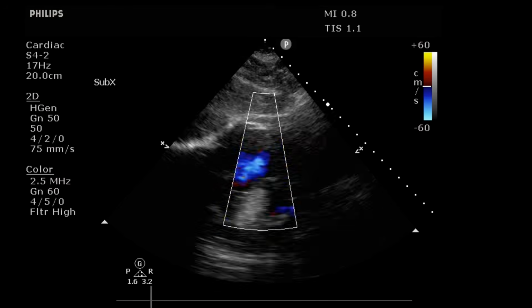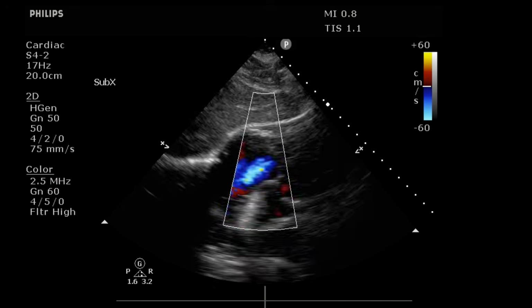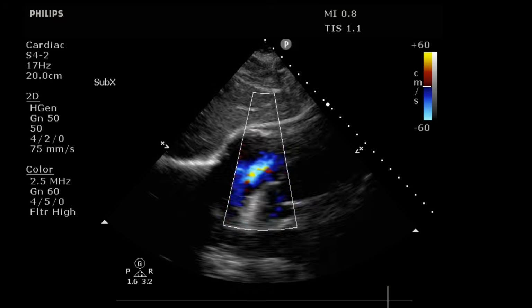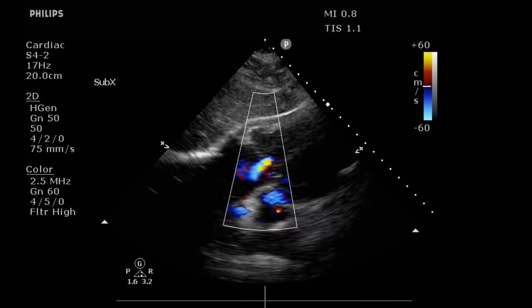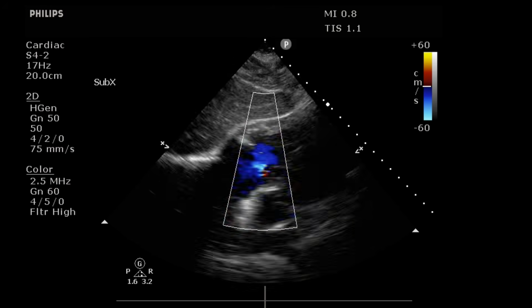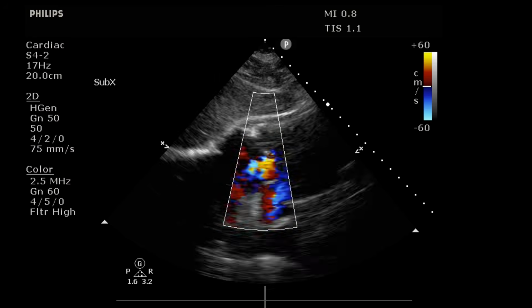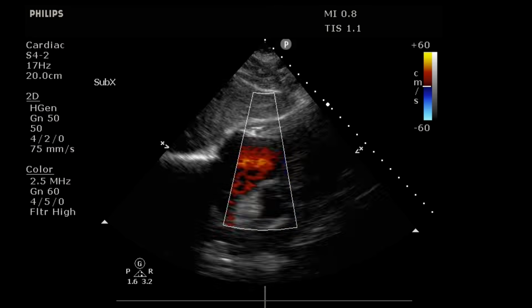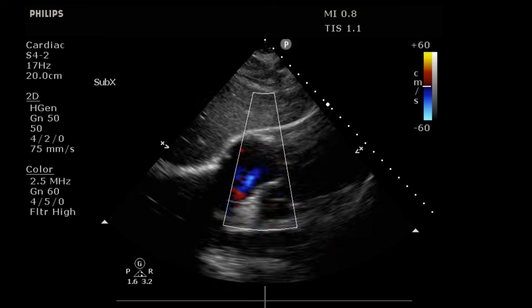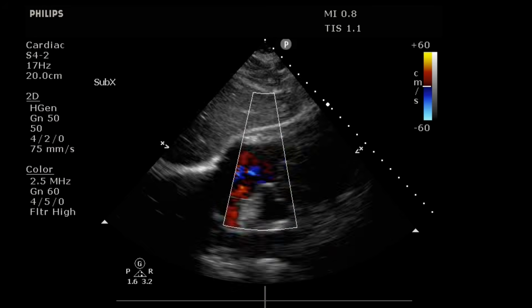And so here's a practical example, right? This is an image of a tricuspid regurgitant jet. And we can see this blue plume that's emanating from that tricuspid valve. And as we look at the orientation of the heart, the blood's flowing to the left and downward deep into the screen, which means it's flowing away from the transducer. So it's going to have a relative blue color. If we were to somehow change the angle of interrogation so that that plume was going toward the transducer, we could turn it into an orangish yellow plume, but since it's going away, it's going to be in this blue.